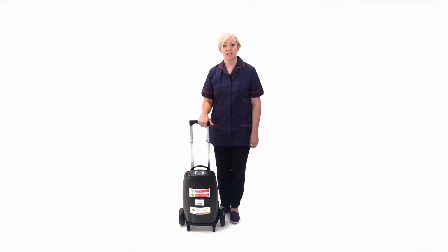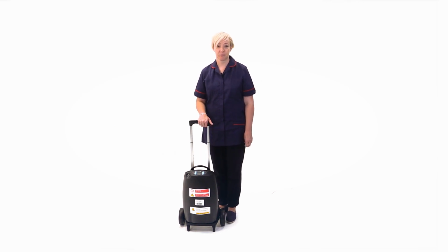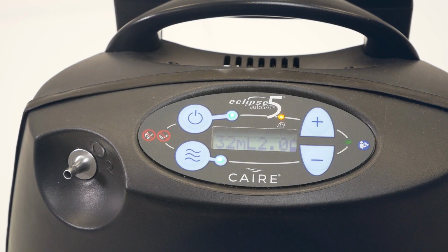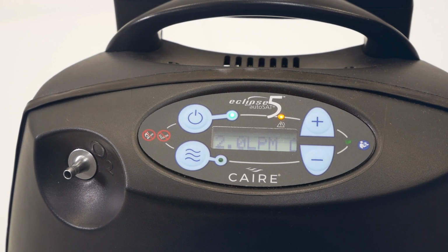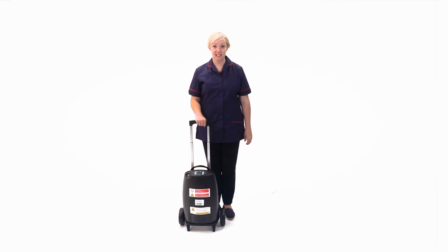No oxygen is being delivered in pulse dose mode. There are a number of reasons why this problem could be occurring. The tubing could be too long. It should be no longer than 2.1 meters or about 7 feet. Check whether a humidifier is attached. If so, remove it. Unit is in continuous mode, so switch over to pulse dose using the control panel. If no inspiration is detected, then you should contact your local oxygen supplier.